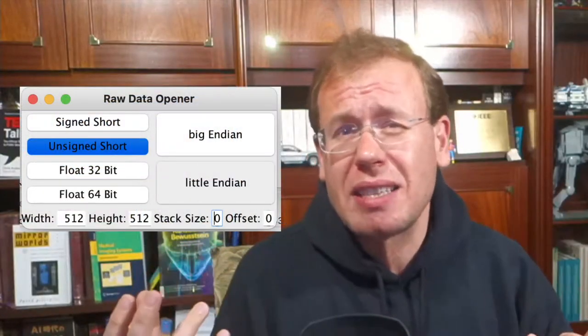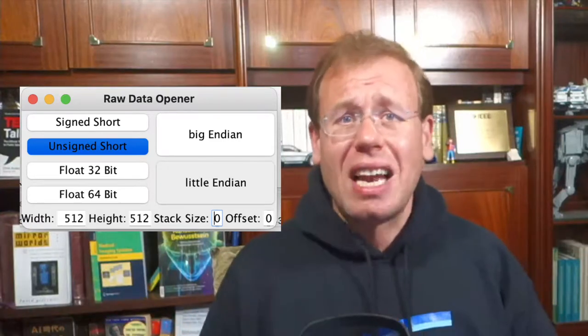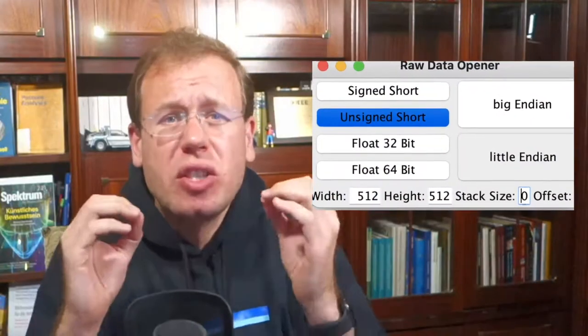So in the next step, we used a software called Conrad. It has a feature called the raw data opener, which allows loading any binary file and interpreting it as an image given a certain encoding. In our case, we knew that the images are 512 by 512 pixels. So using Conrad's drag-and-drop feature, we quickly figured out the encoding of the image data. This resulted in images as shown here. This way, we then figured out that the vendor is storing four additional images in the header of the file, which also explains the file size.